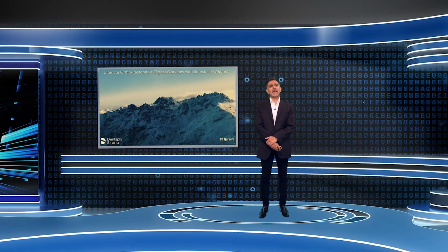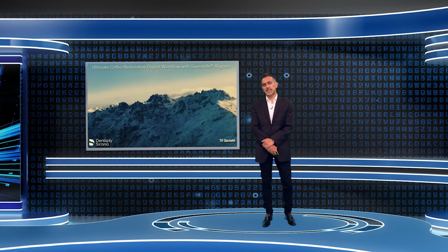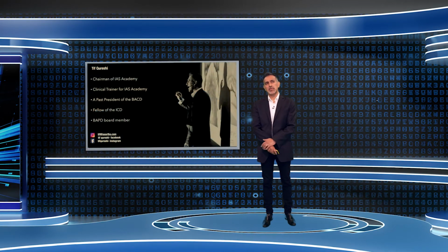Hi, we're going to talk today about the ultimate ortho-restorative digital workflow with SureSmile Aligners. I'm Tif Qureshi, I'm chairman of the IAS Academy. I'm a general dentist. I've been involved in cosmetic dentistry for many years, but I do use a lot of aligners for ortho and restorative treatment, which is what we're talking about today.